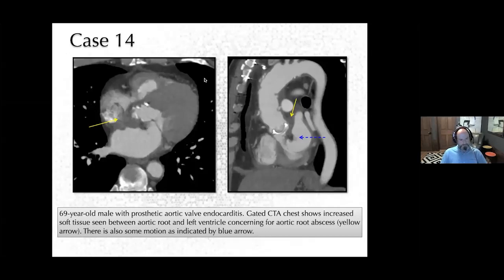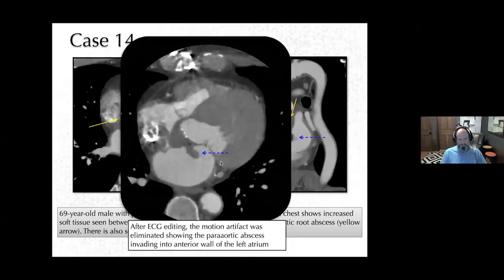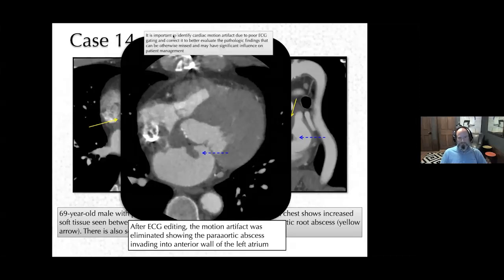Case 14: a 69-year-old male with prosthetic aortic valve endocarditis. Gated CTA shows increased soft tissue in the retro-aortic space between the aortic root and left ventricle, concerning for aortic root abscess. There was also possible motion artifact. ECG editing eliminated the motion artifact and confirmed the abscess was extending through the aortic wall with protrusion of abscess tissue into the left atrium. Identifying and correcting cardiac motion with ECG gating is critical to avoid missing such important findings.